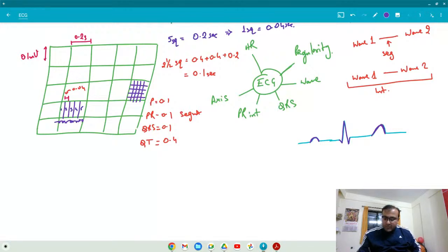There are three terms. Next thing, the duration between the waves. Two waves are there, and I'm talking about the duration in between the two waves.